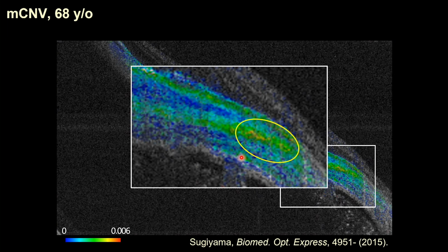Okay, and dura mater normally exists around the optic nerve head, but by the elongation of the eye, it is stretched into the macular position, and we believe we are watching it. Okay, it's a very high birefringence, meaning a very high density of collagen. And also again, sorry, maybe I mistook the order of explanation here. So there are four layers here, okay?